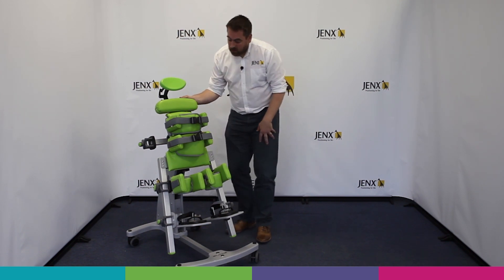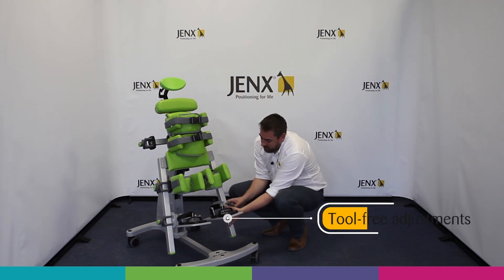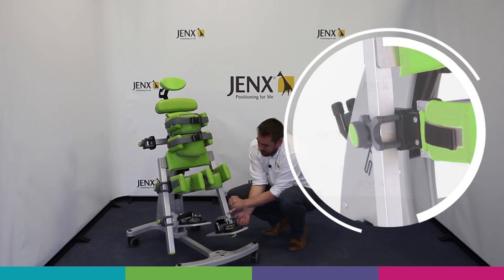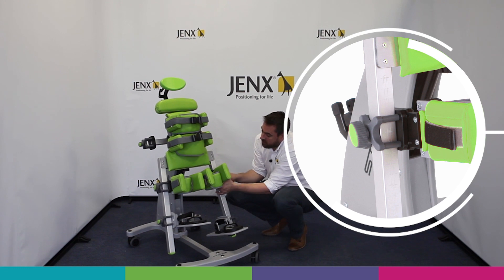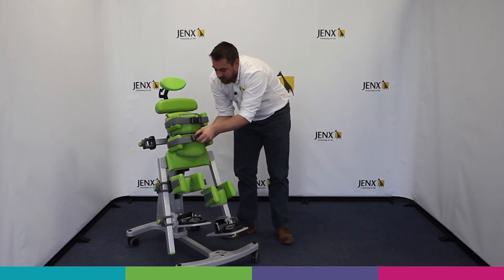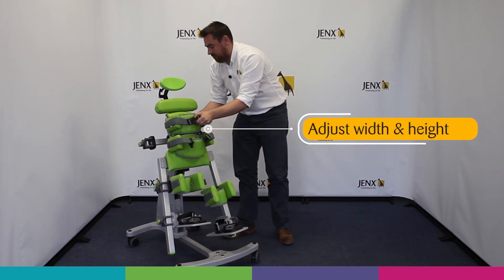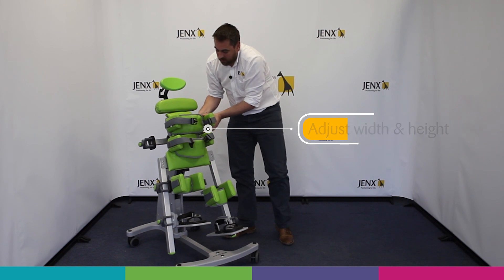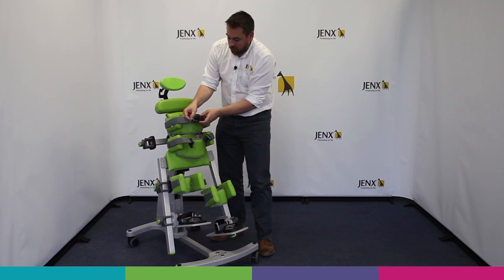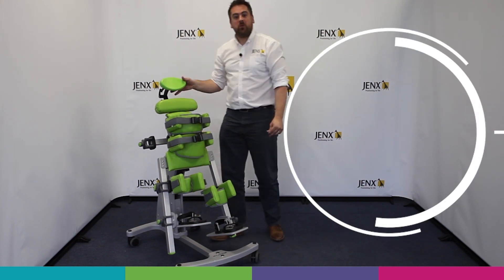Stands has been designed with simplicity and ease of adjustment in mind. Any of the key adjustments for growth are tool-free, meaning that I can adjust the foot plate height using the calibrated chart down the front, same with the knee blocks, and simply and easily adjust the width on the hip guides and the width and height on the trunk support.